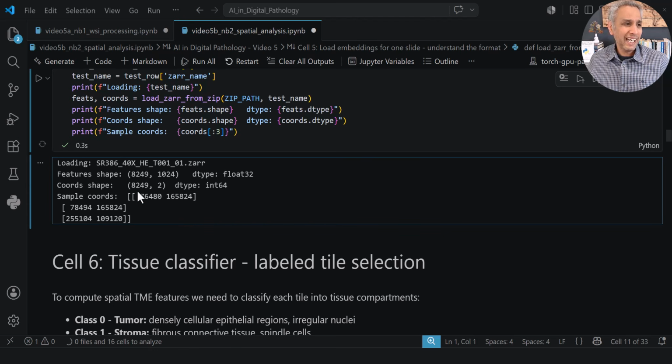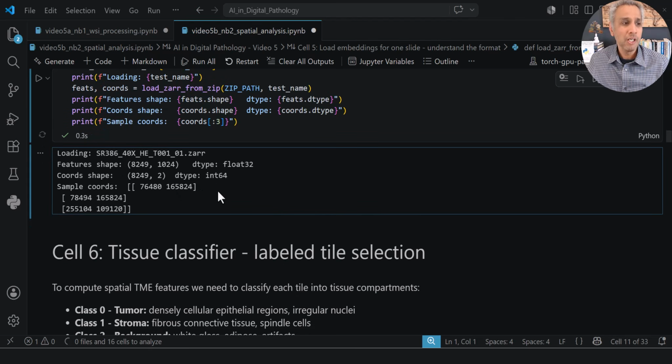Okay, and that stride is one of the reasons why the stromal adjacency metric probably fails later on. Things are not under our extreme control. Ideally, I would have all the slides. I would define what the patch size or the tile size is, and what the stride is, so I can do all the analysis myself. Obviously, we are loading some public repository here, so we have to play by what data we have access to.